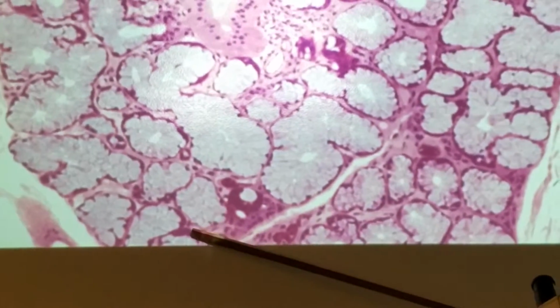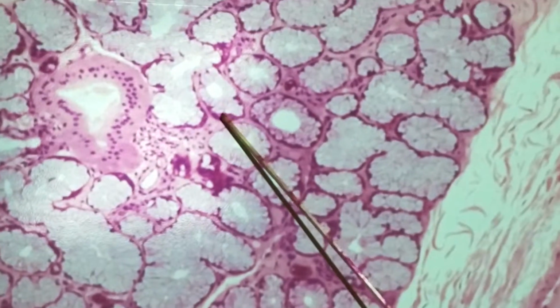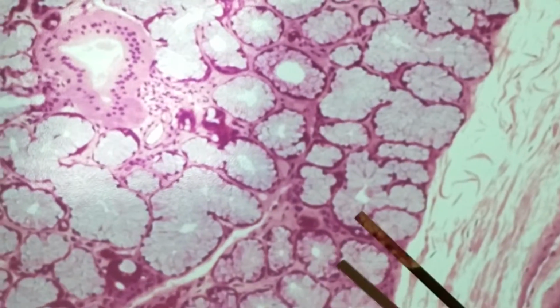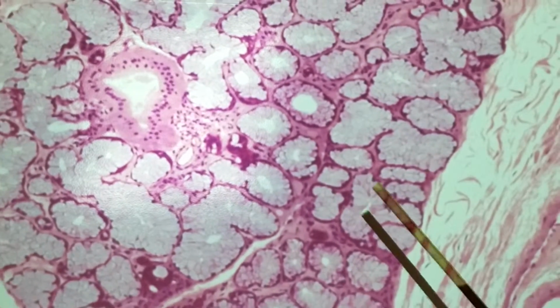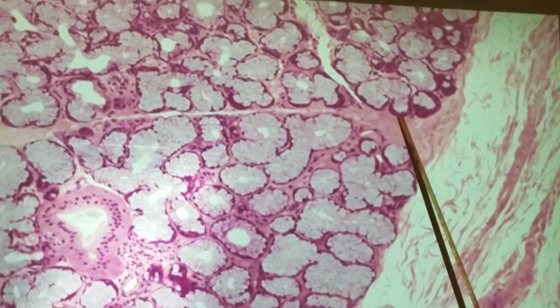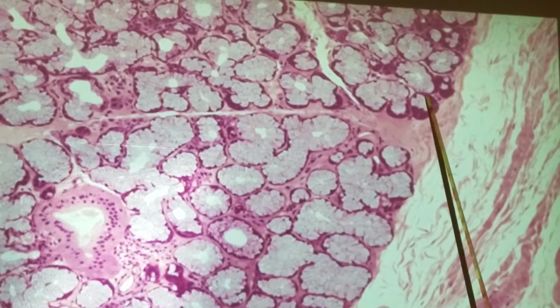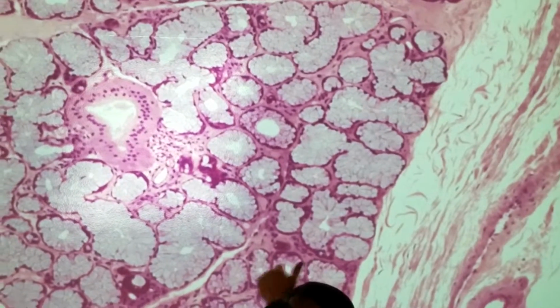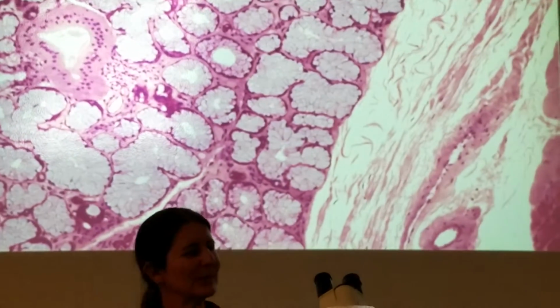So here's another one right there. There's a good one. So we go for the obvious ones, the real good, thick little hats that sit on them. So any of these, there's some good ones up here. That's a great one. So serous demilune, crescent moon.